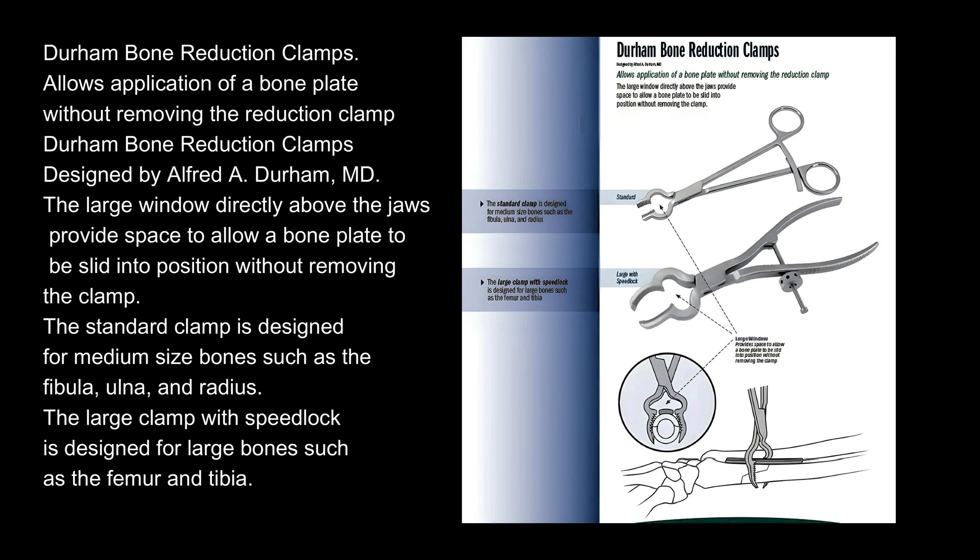Durham Bone Reduction Clamps, designed by Alfred A. Durham, MD. The large window directly above the jaws provides space to allow a bone plate to be slid into position without removing the clamp. The standard clamp is designed for medium-sized bones such as the fibula, ulna, and radius. The large clamp with speed lock is designed for large bones such as the femur and tibia.